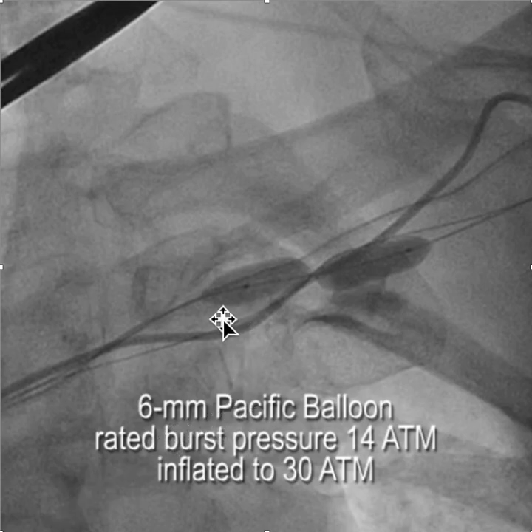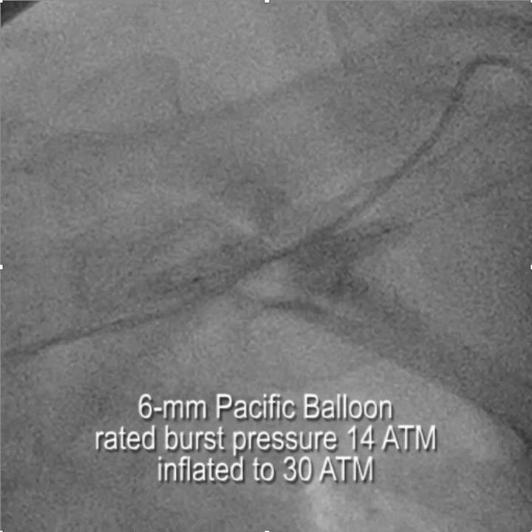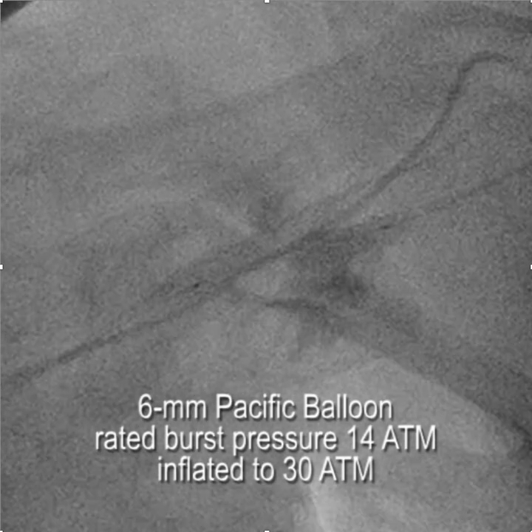We started with a 4mm balloon — that didn't do the trick. So we went to the 6mm balloon, again with a rated burst pressure of 14 atmospheres. You can see the waist just isn't going anywhere. So I inflated the balloon until it bursts — you can see the balloon bursting.